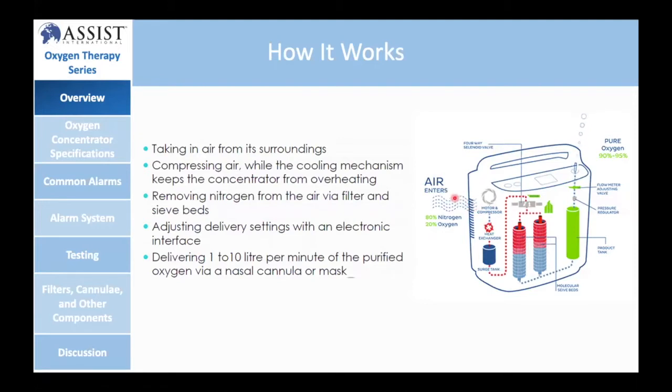This is done by a negative pressure to suck air in. And because when you compress air the temperature increases, we have a heat exchanger to cool it down.